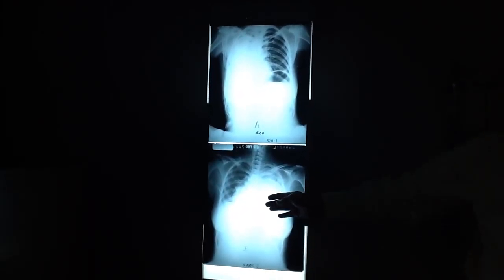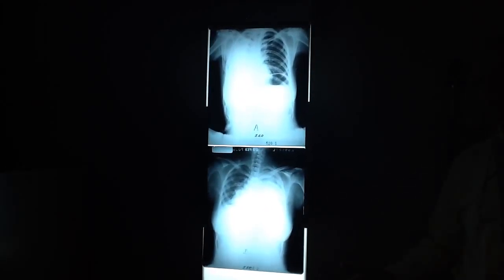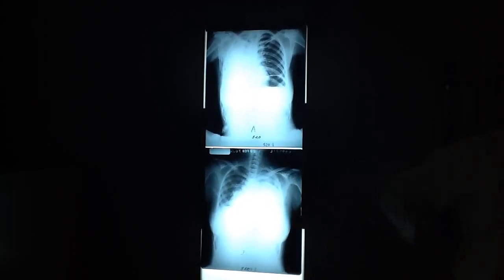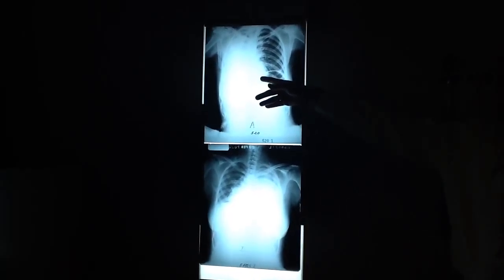Away from the density. So if it moved away from the density, something's doing what? Pushing. Something's getting bigger and it's pushing it out of the way. Which way to go on this one? Toward density. Toward.